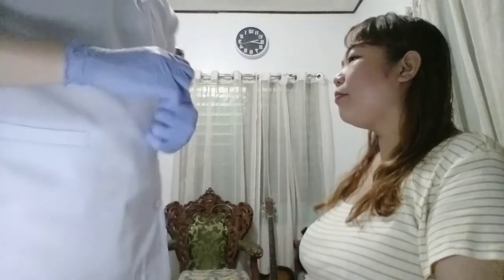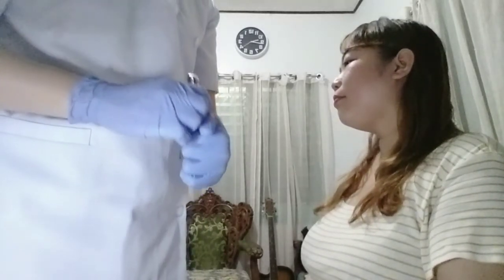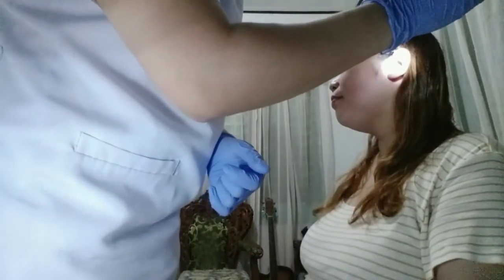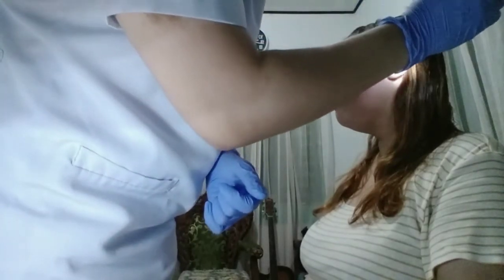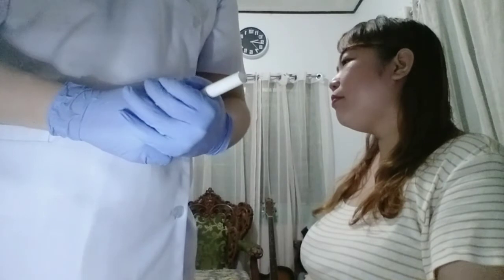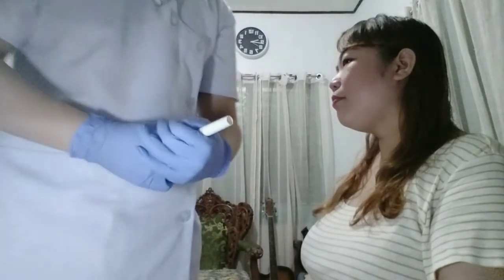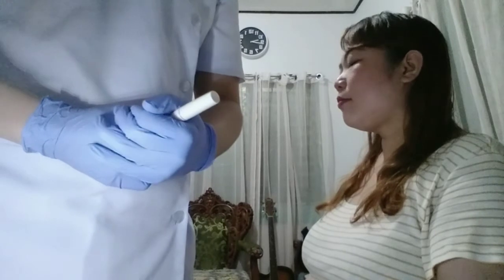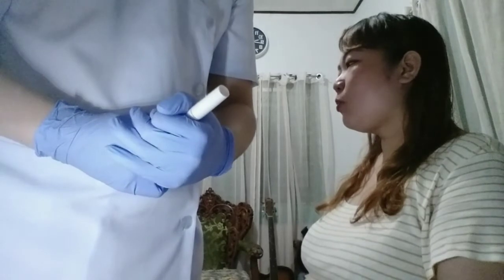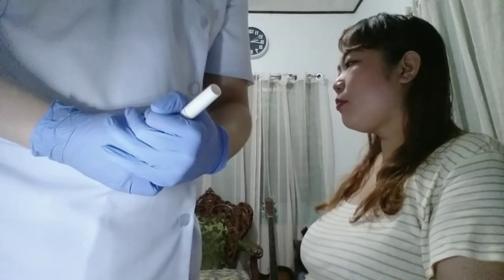Next, I'm going to inspect the tympanic membrane using the pen light. I'm going to inspect it for the following: the color, consistency, and landmarks. So now I'm going to put the pen light onto your ear, and I'm going to ask you to swallow. Okay. I'm looking at this: the color should be pearly gray, shiny, and translucent, while the consistency should be intact, and may show movement when swallowing. The landmarks should have a cone of light, umbo, handle of malleus, and short process of malleus easily visualized.